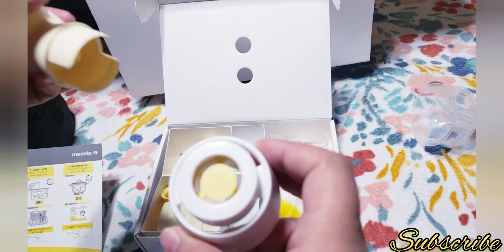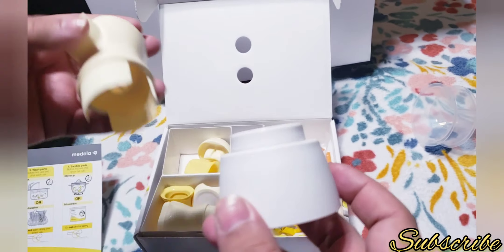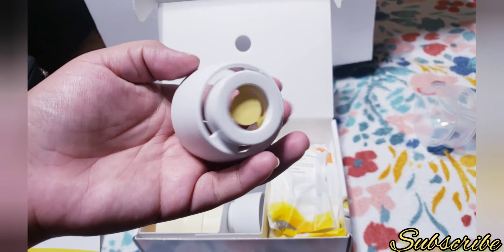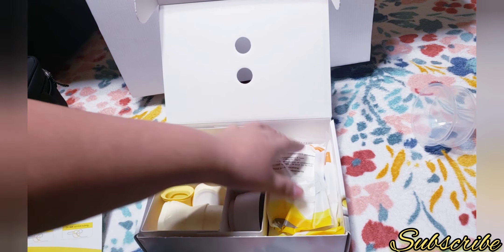This is the valve — I think. I'm not sure what it is; I need to read and figure out what all these parts are. Like I said, it has a bunch of parts and it looks a little bit complicated.